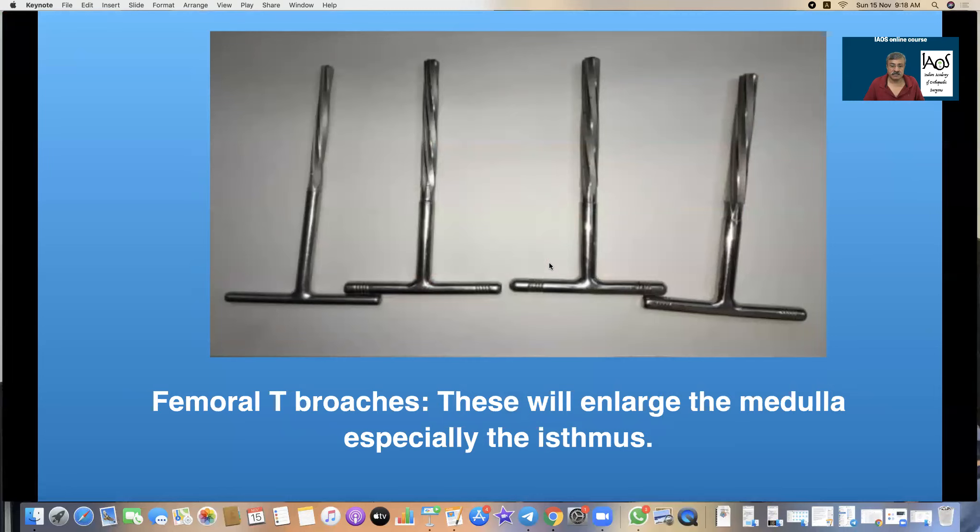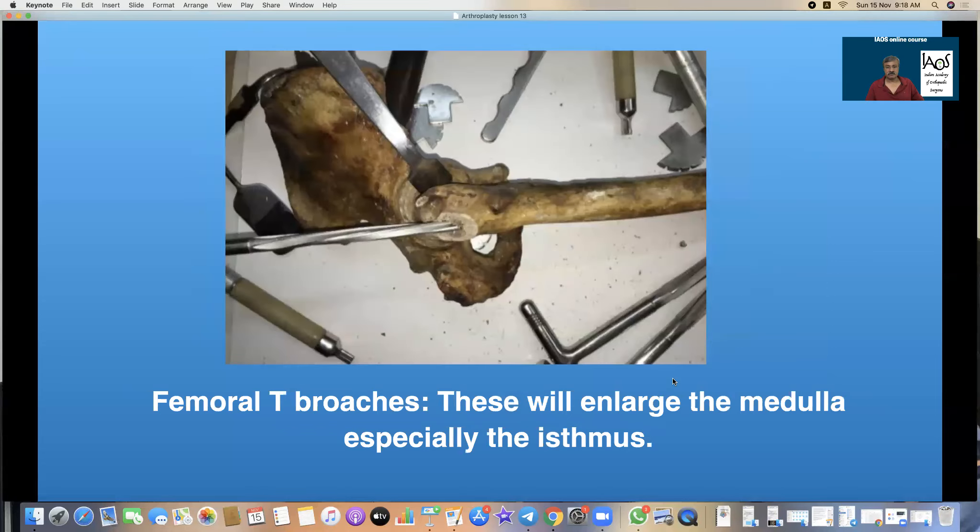These are T-broaches which will enlarge the medulla up to the isthmus. These are for short stems; for longer stems you get longer T-broaches. Some companies also provide a power tool for this, but I personally like to do it manually. After the box chisel has made its entry, we go as far back posteriorly as possible aiming for the medial part of the femoral stem as the T-broaches gently enter into the femoral medulla.